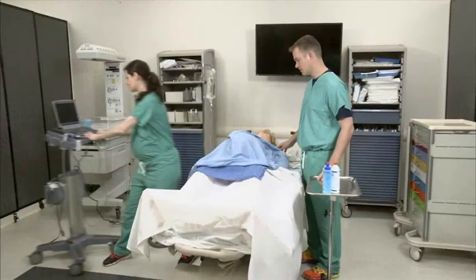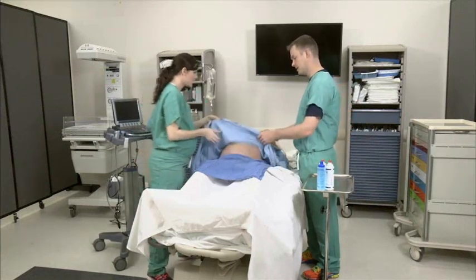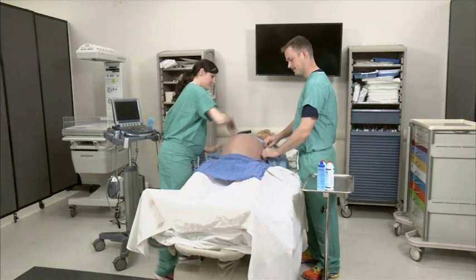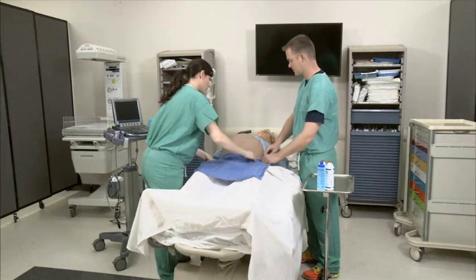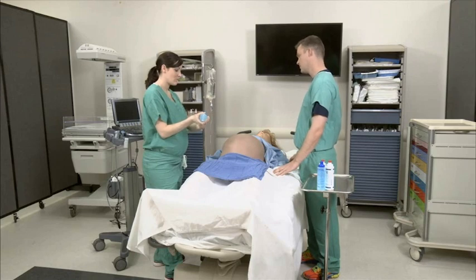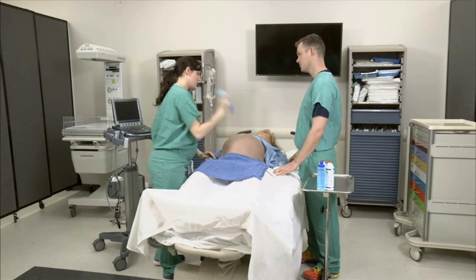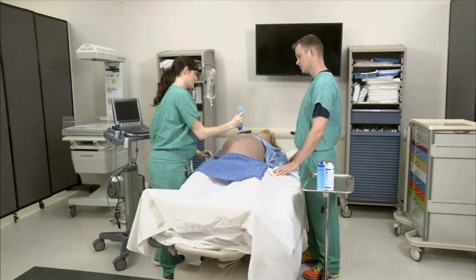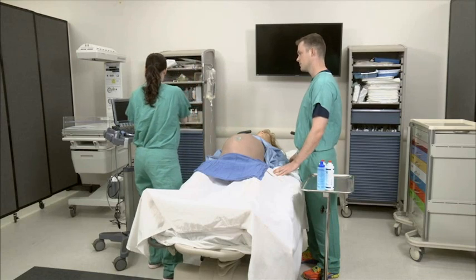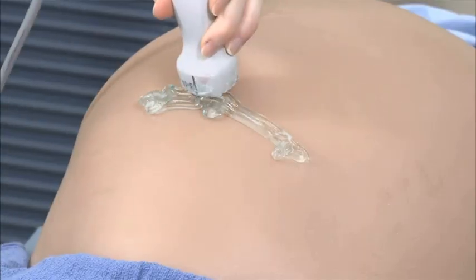Before the procedure, do ultrasonography to determine the volume of amniotic fluid, the location of the placenta, and the fetal presentation. Verify the fetal presentation even if abnormal presentation was previously identified, because spontaneous version into a normal presentation can occur. Give a uterine relaxant such as terbutaline 15 to 30 minutes before the procedure.